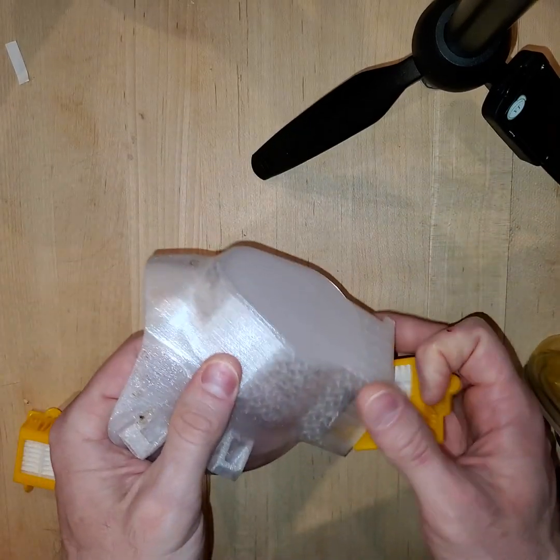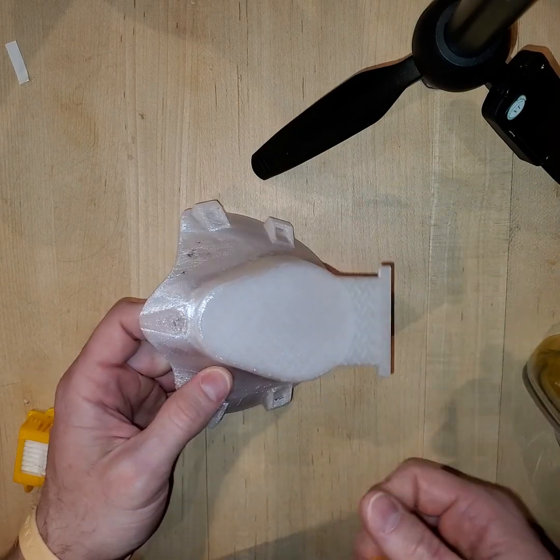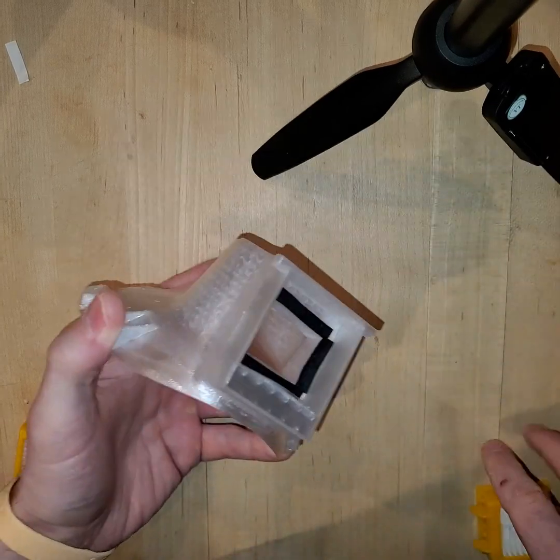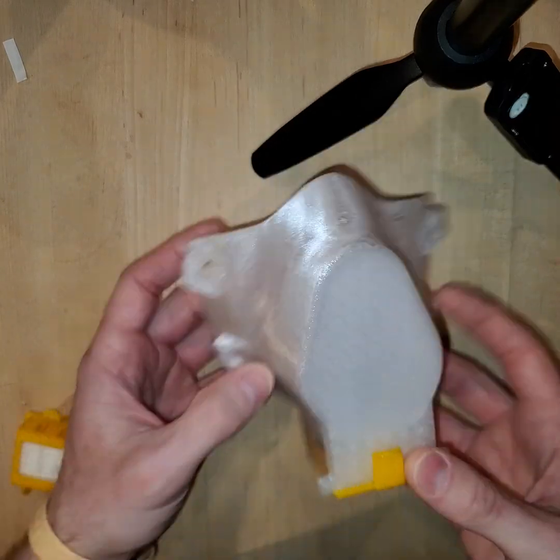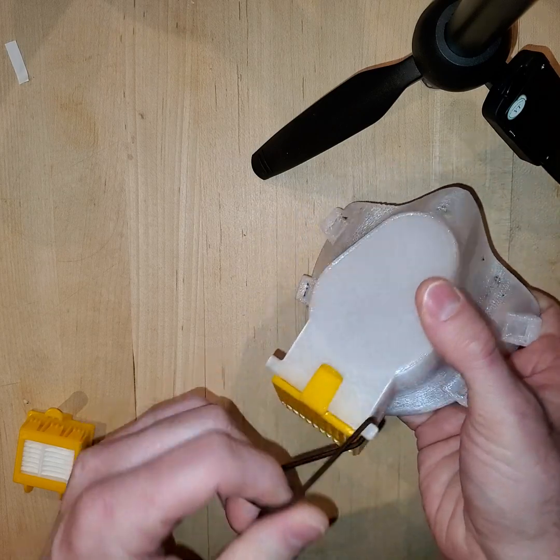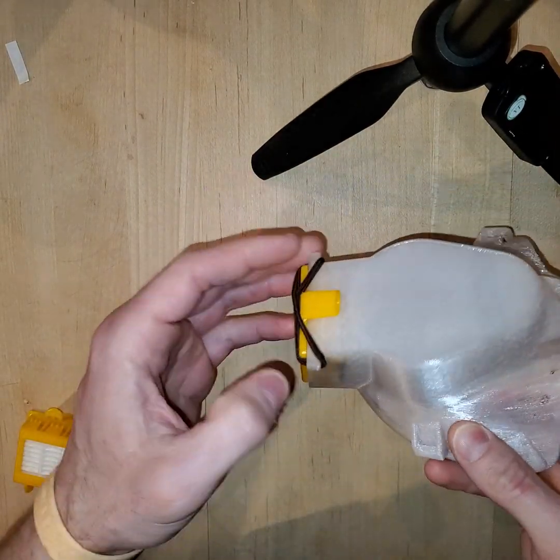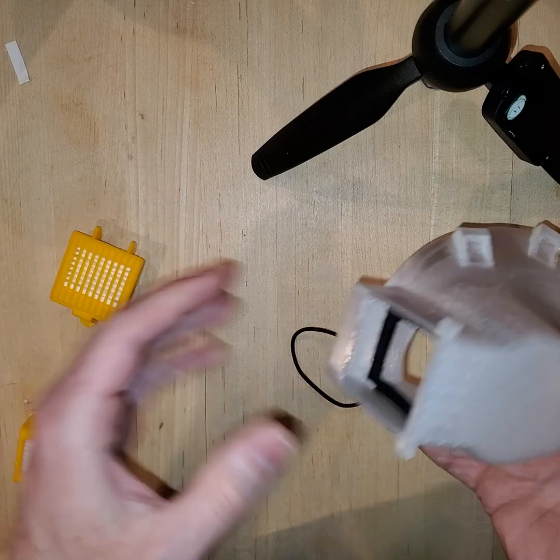Same thing with this mask I created. It uses the same exact port, once again lined with that 1/16 inch foam tape. Now, this is an all-in-one deal. It prints like this. Ignore the burn marks in my print, that's just from testing. But now you have an all-in-one solution where you can pop this in and take it out whenever you need to replace it. If you're wondering why there are these two little tabs here, well, once again, the rubber band. It's to lock and hold that tight so that it doesn't come out at all. And once again, you just take this off, pop out your filter, and away you go.